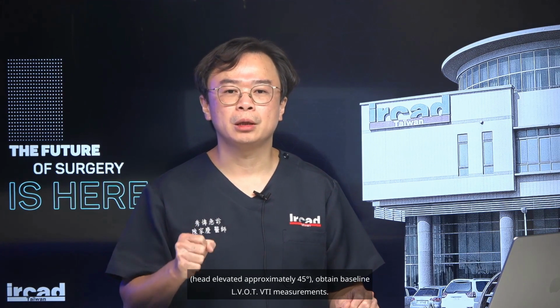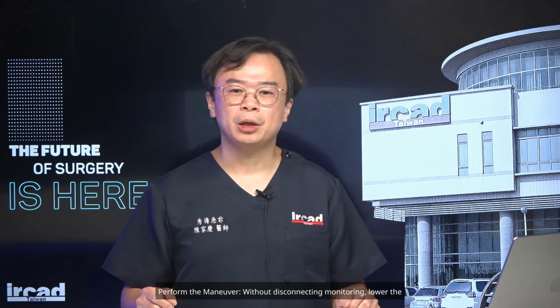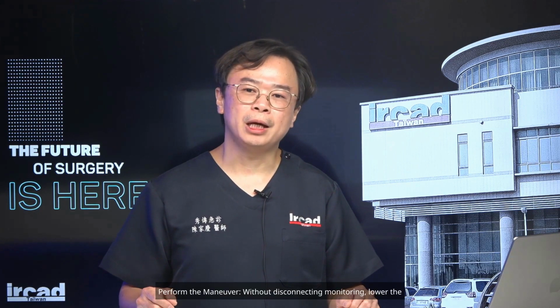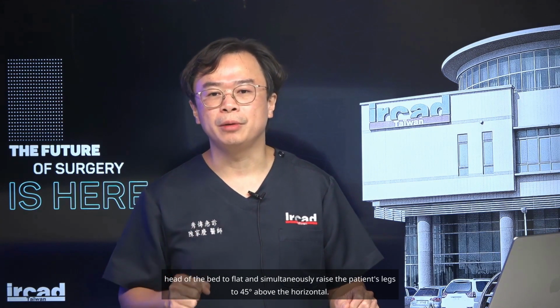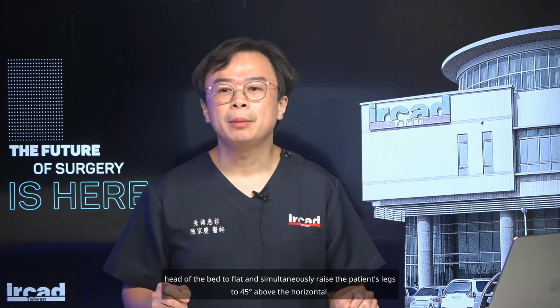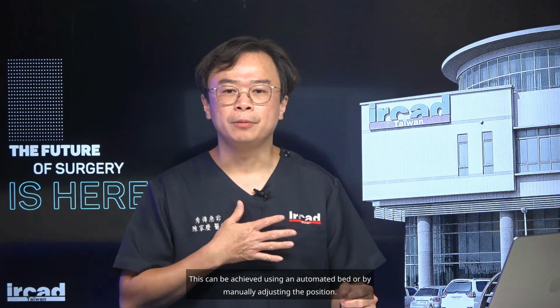Timing and steps of the PLR method. 1. Baseline measurement. With the patient in semi-recumbent position, head elevated approximately 45 degrees, obtain baseline LVOT VTI measurements. 2. Perform the maneuver. Without disconnecting monitoring, lower the head of the bed to flat and simultaneously raise the patient's legs to 45 degrees above the horizontal. This can be achieved using an automated bed or by manually adjusting the position.